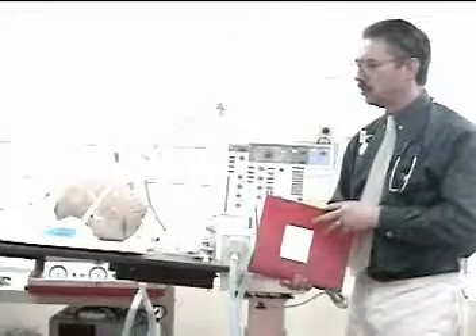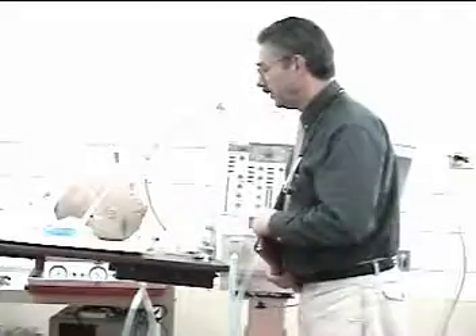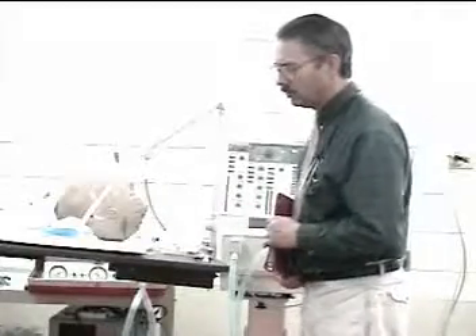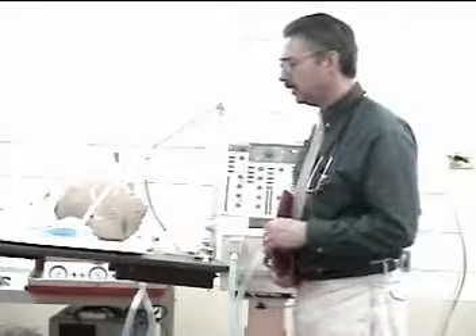When you enter the patient's room, the first thing you need to do is explain to the patient what you are there for. For example: 'Hi Mr. Jones, I'm Dave Zoback. I'm here to check your ventilator. You may hear some alarms as I go through and check the machine. I'll try and be as quiet as possible.'